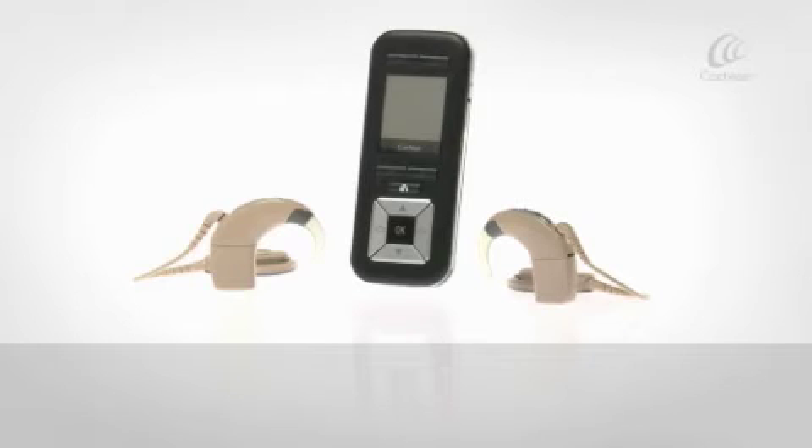If you are a bilateral recipient, your remote assistant can be used to control both processors.